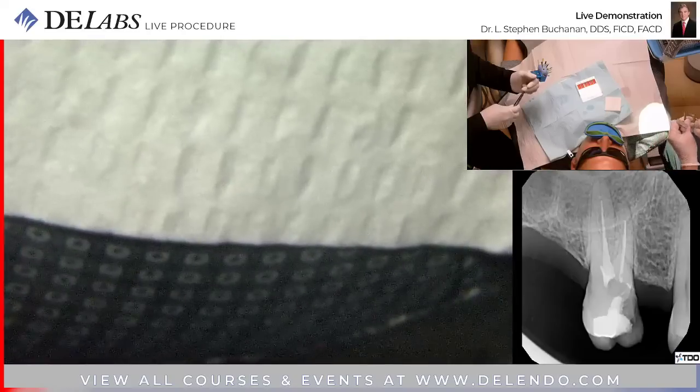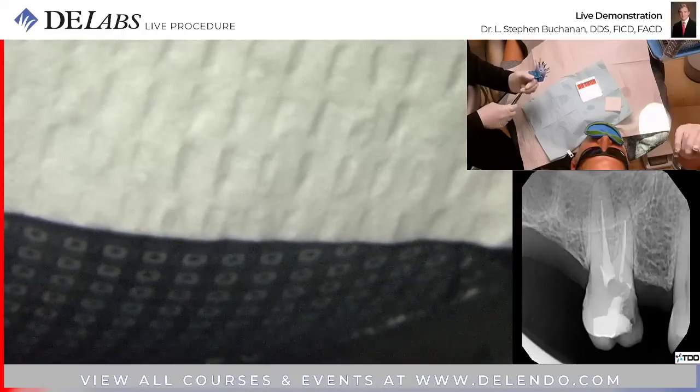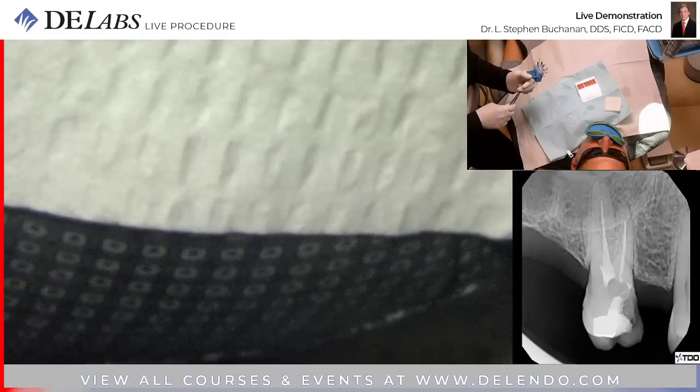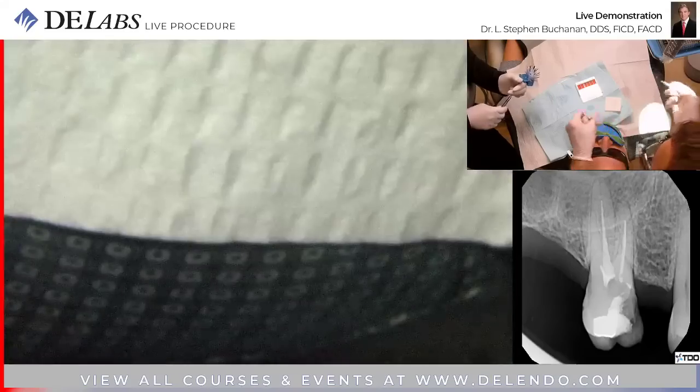Just empirical. Here's the thing, we're going to always fit cones in a wet canal because a dry canal is going to stop it way shorter than where it'll be with a sealer. But the sealer's still more lubricious, and we're putting a downward pressure on it, so it just corks in there. Yeah. Okay, so that's good.